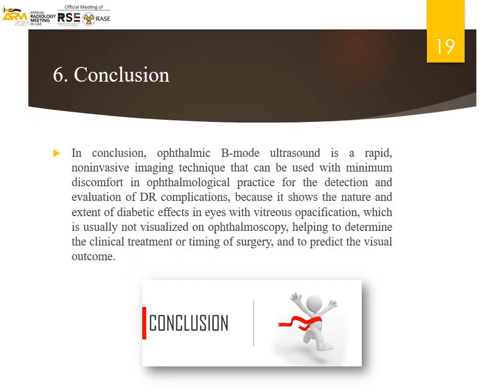In conclusion, ophthalmic B-mode ultrasound is a rapid non-invasive imaging technique that can be used in ophthalmological practice with minimal discomfort for the detection and evaluation of diabetic retinopathy complications. It shows the nature and extent of diabetic effects in eyes with vitreous opacification, which is not visible on ophthalmoscopy, assisting in determining clinical treatment, surgery, timing, and visual outcome.